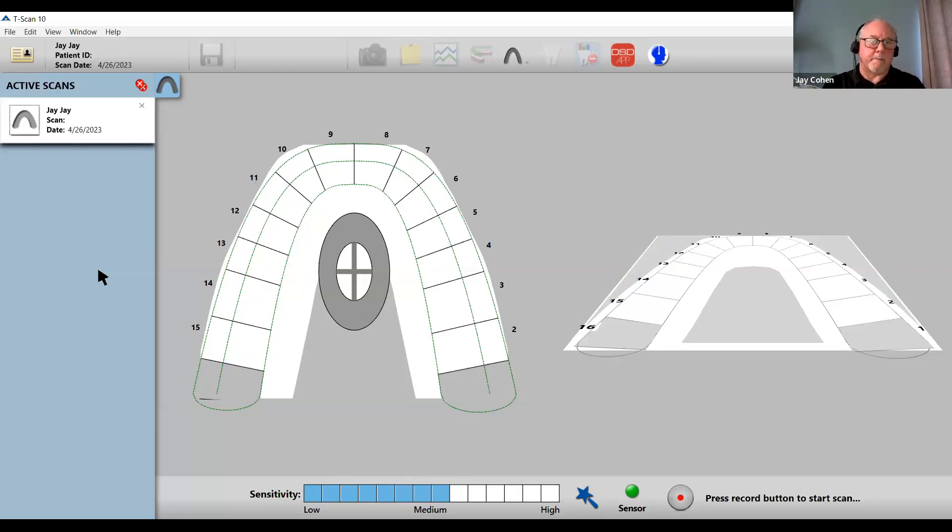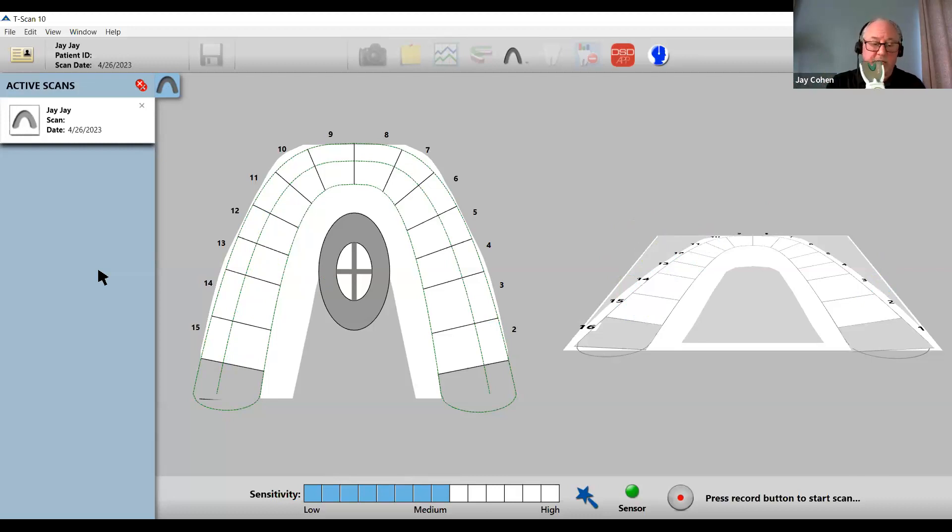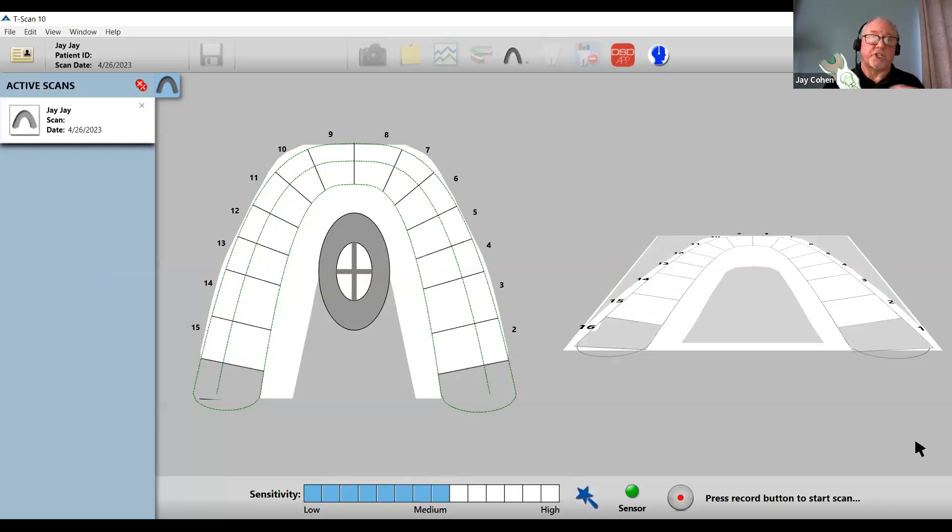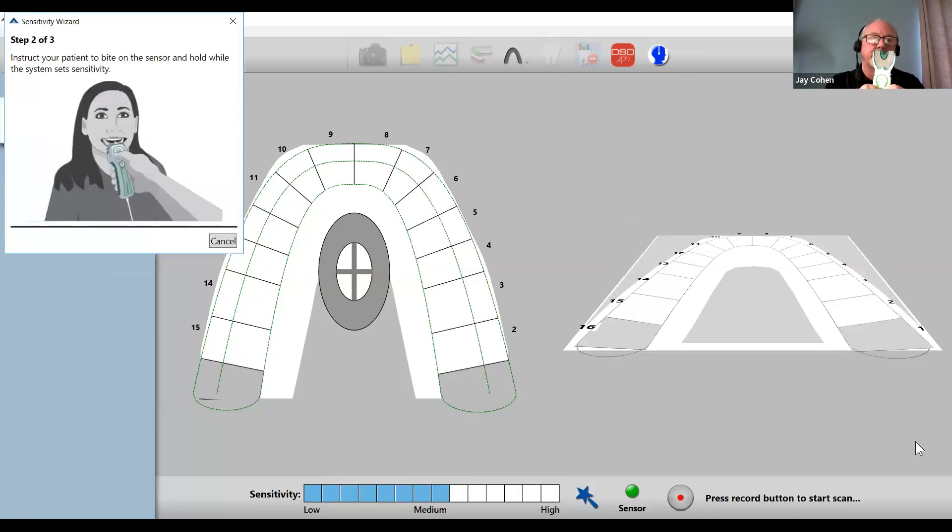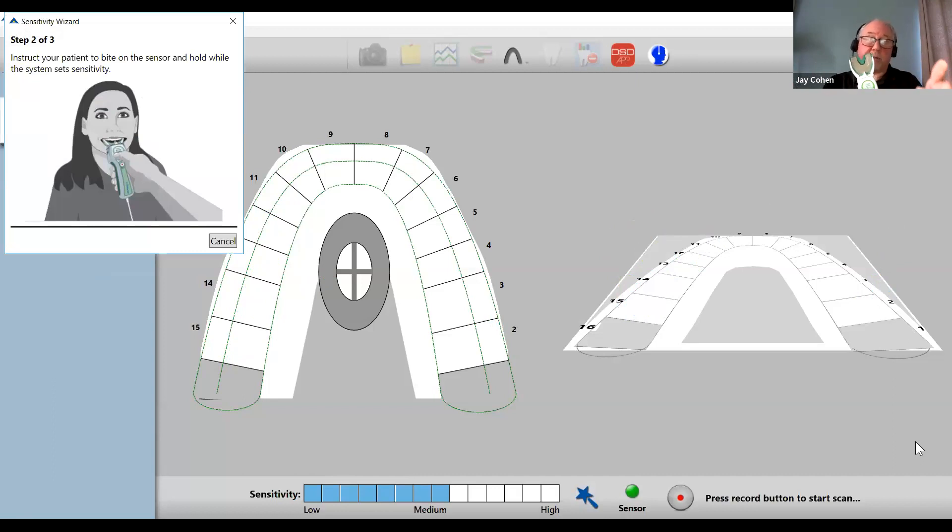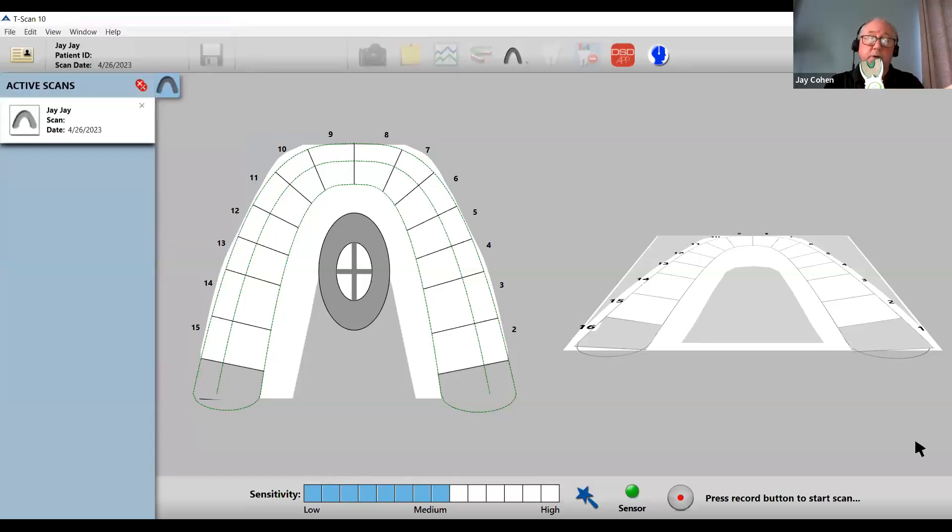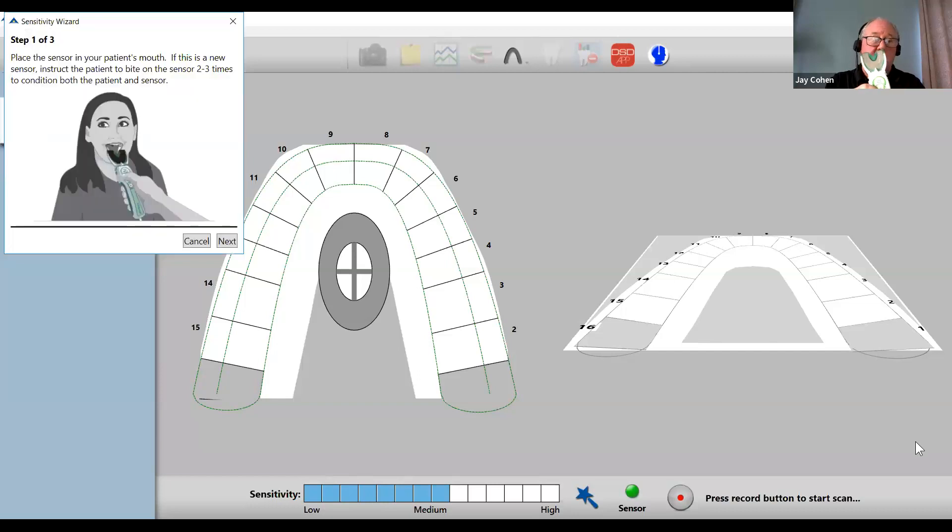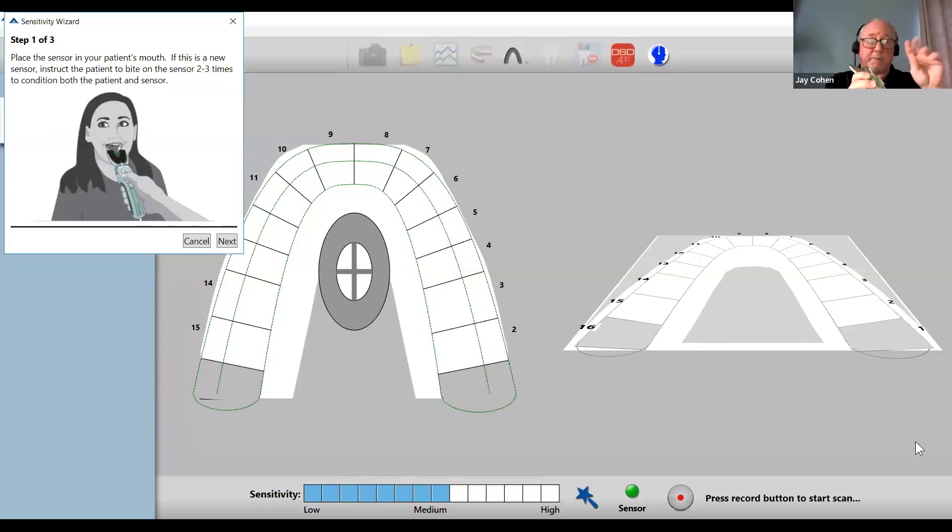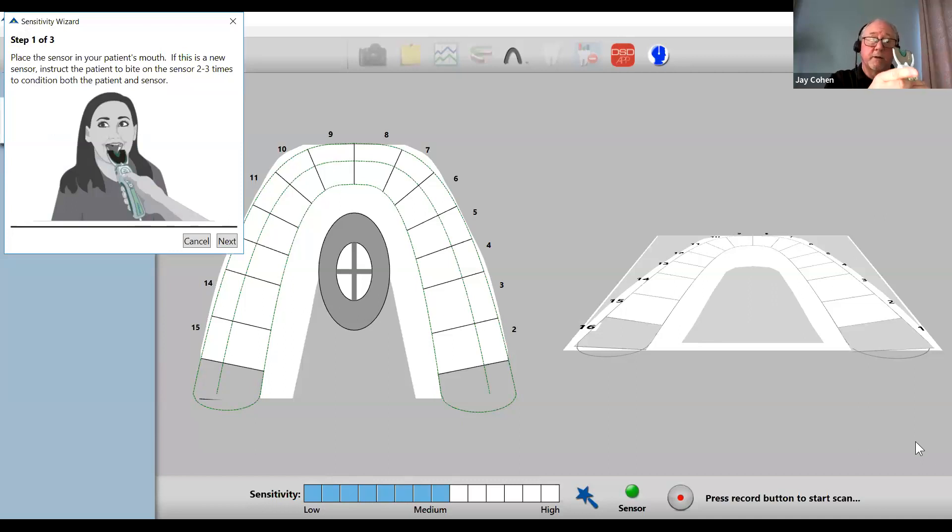Another way to evoke or set the sensitivity is from the handpiece. If you click both the plus and minus button together at the same time, it will open up the sensitivity wizard. If you hold it too long, it jumps right to step two. The minus button will close the sensitivity wizard. You can go ahead and have the patient practice bite, then hit the plus button to advance to step two. Then clench and hold.